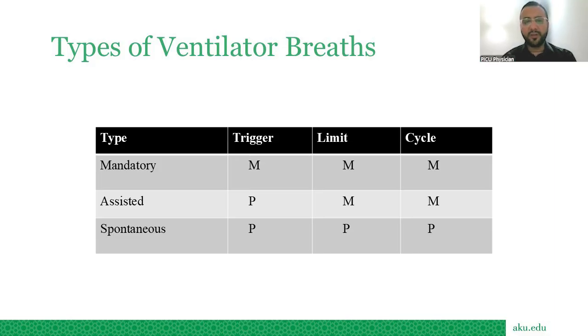Okay, now coming to the types of ventilator breaths. There are three types of ventilator breaths. Two slides back, we were discussing the mechanics that are associated with each and every breath. Now we are discussing the types of breaths. So don't confuse these two slides.